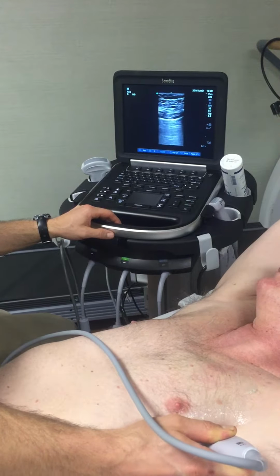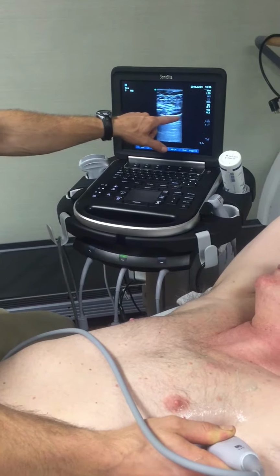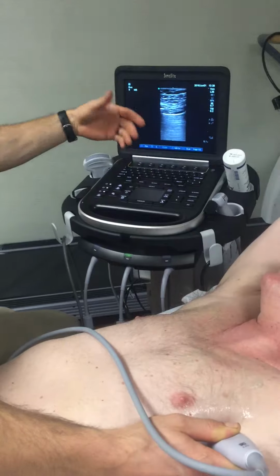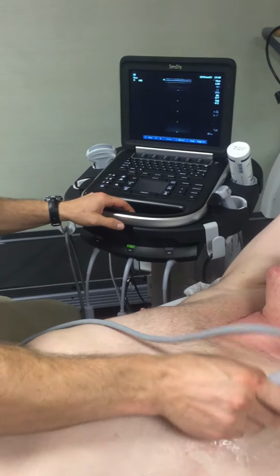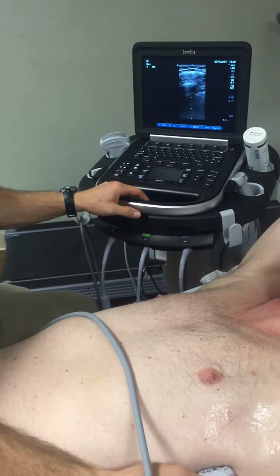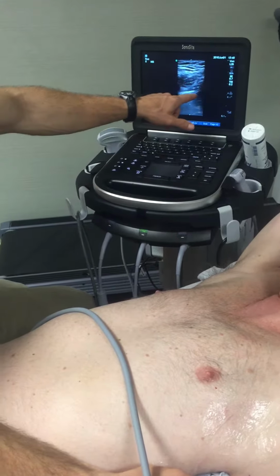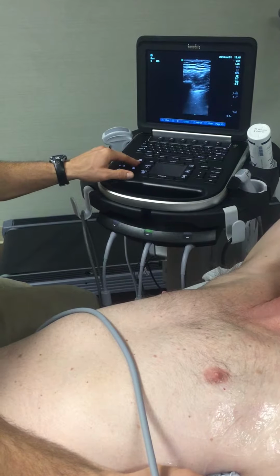So stage or position 2 is just about here, kind of anterior axillary line. You see the same thing. You see the pleura sliding back and forth. You're looking for B lines or artifacts or signs of pneumonia. And then you slide further down. It's almost like posterior axillary line here. The same thing, you see the pleura here sliding. You can adjust your depth.